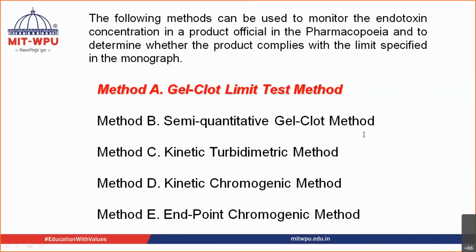Jivika, the test is something very different. We are trying to detect, why don't we just add an antibacterial agent? We are not adding this agent in order to kill the microorganism. We are using it to detect whether some pyrogen or endotoxin is present inside my formulation. It is not used for sterility, it is evaluation. Okay, got it? Okay, fine.